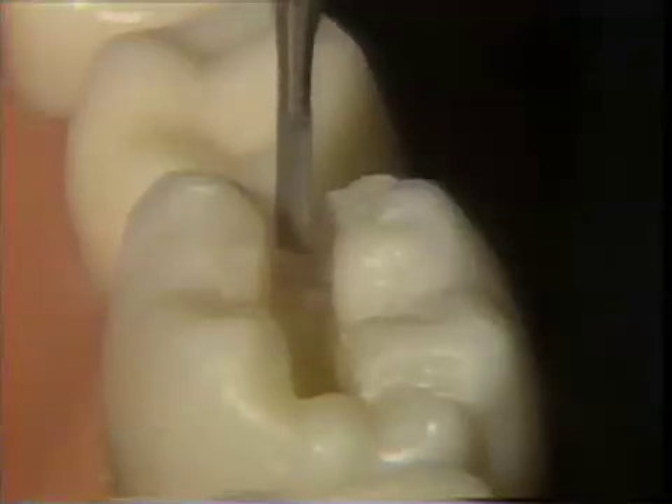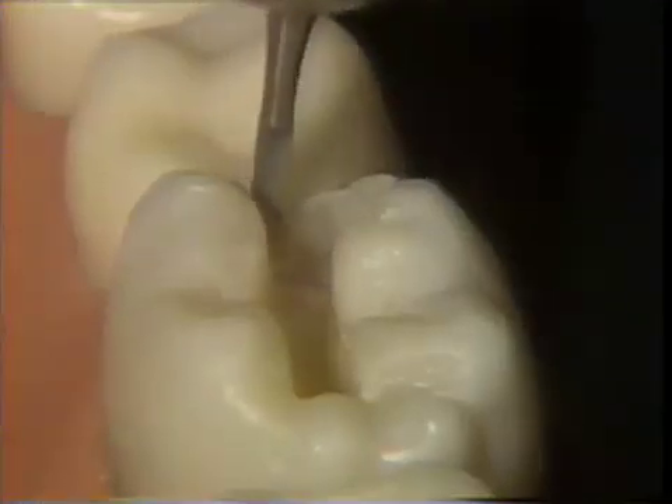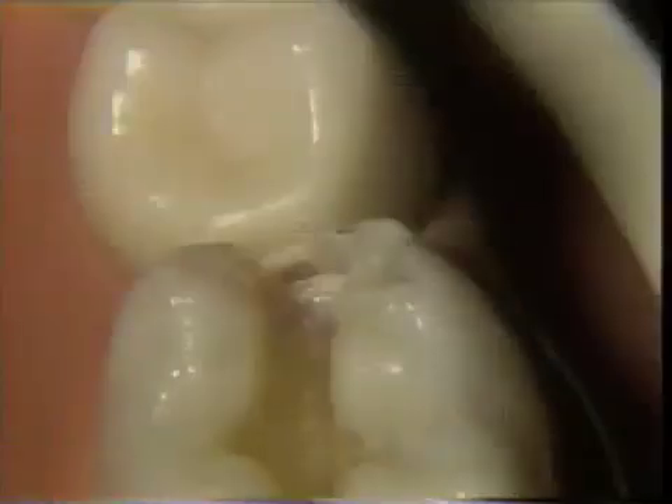The marginal ridge is now thinned even more. Very often, as is demonstrated here, a piece of the thin marginal ridge will break away. This creates no problem.